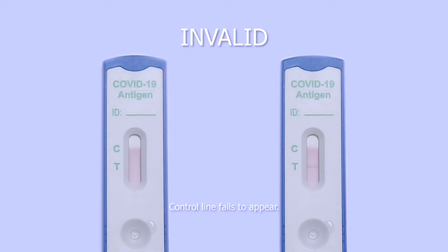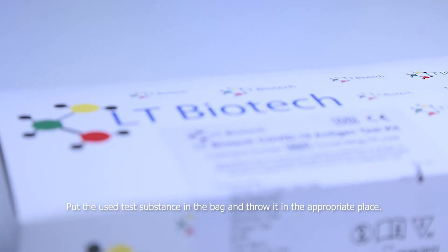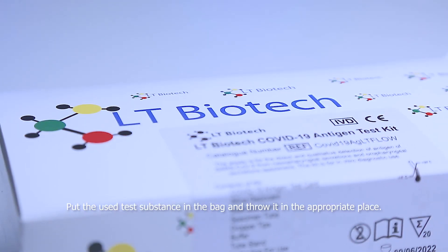Invalid — control line fails to appear. Step 8. Put the used test substance in the bag and throw it in the appropriate place.